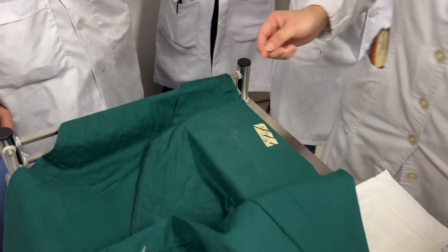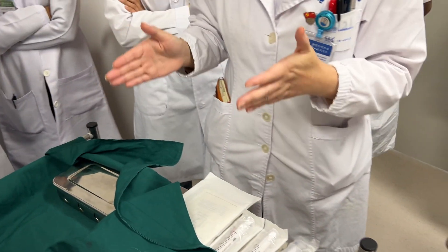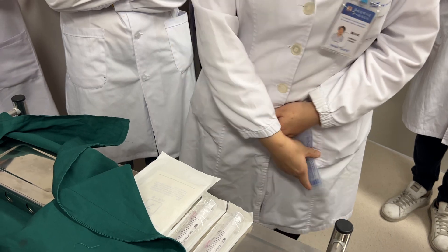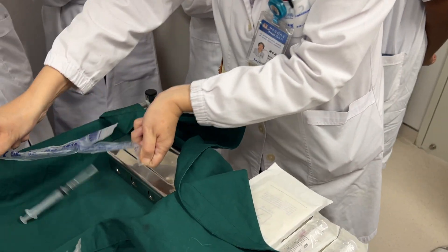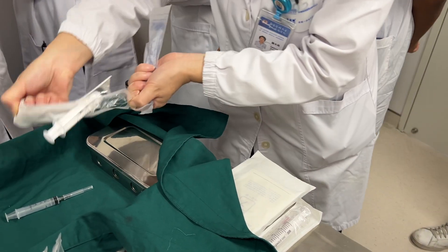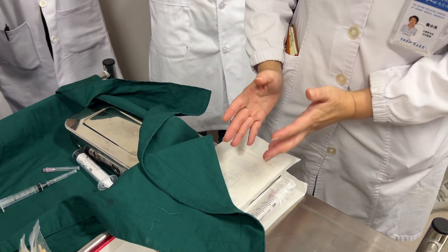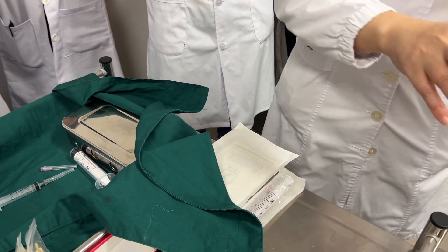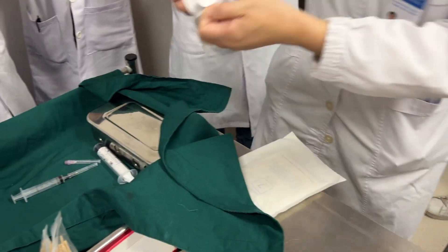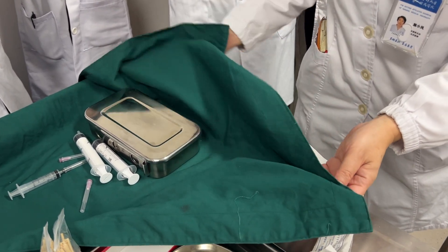First you open the sterile pack like this. This bag contains a sterile field. You need to prepare all the needles and equipment onto this sterile area. Once you wear the gloves, you cannot touch outside the sterile area. All this area is a sterile area.